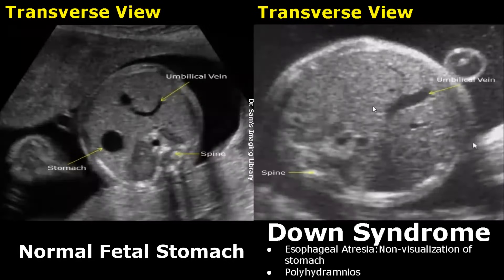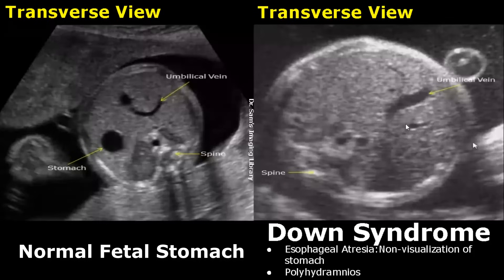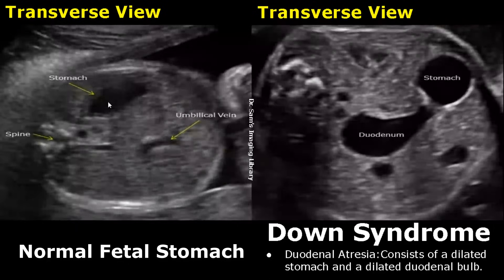A normal fetal stomach is seen as a round anechoic structure in the abdomen in a transverse view. A birth defect known as esophageal atresia is also sometimes associated with Down syndrome — the esophagus does not develop properly, leading to non-visualization of the stomach because no fluid reaches it and it remains persistently invisible. Duodenal atresia can lead to a dilated stomach and duodenum, giving a double bubble appearance, and in some cases it is associated with Down syndrome.